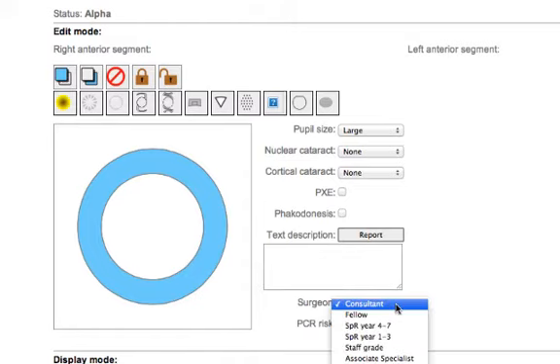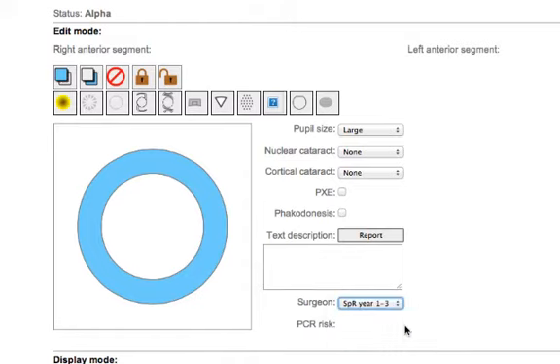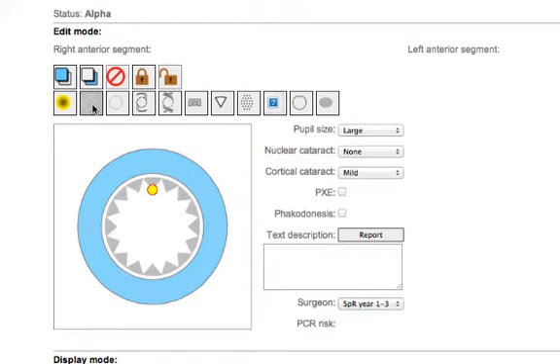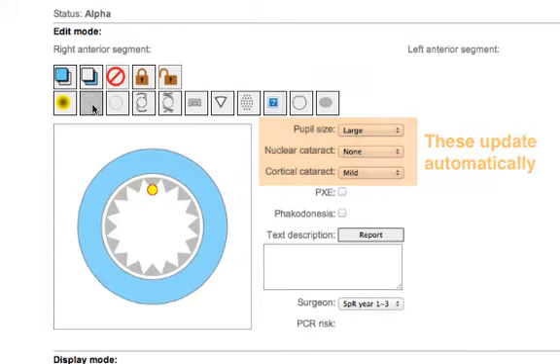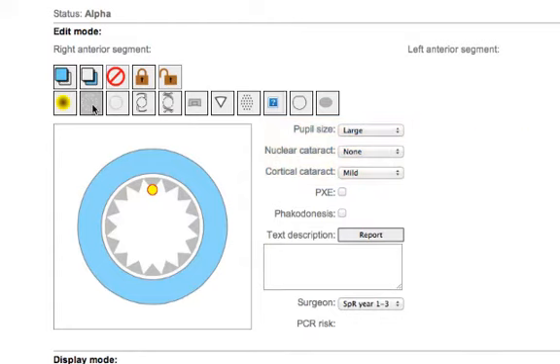If we start off with a junior surgeon with a very simple cataract, you'll recognize the drawing package here linked to the menu choices on the right hand side. By adding that cataract the menu choice also became selected, automatically updated, avoiding duplication of effort.